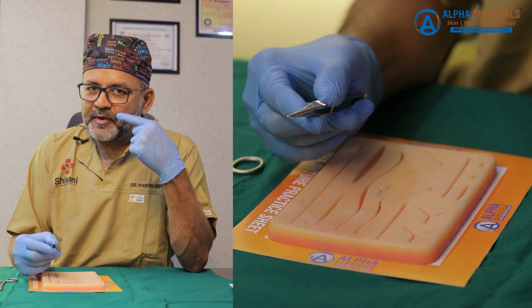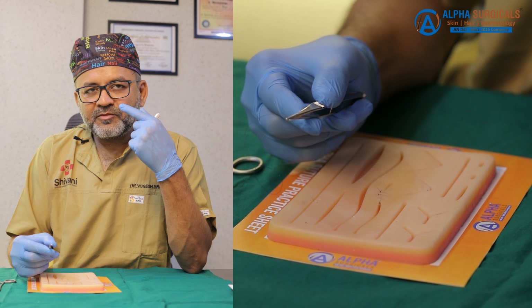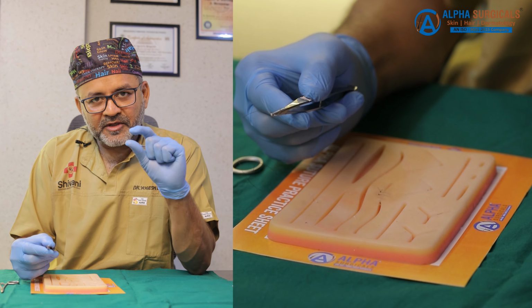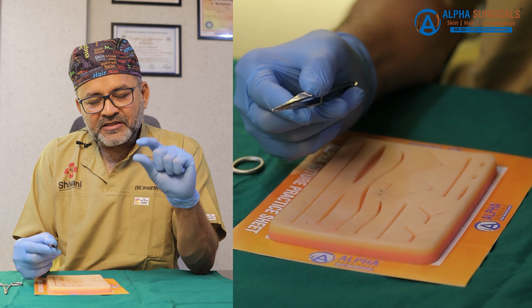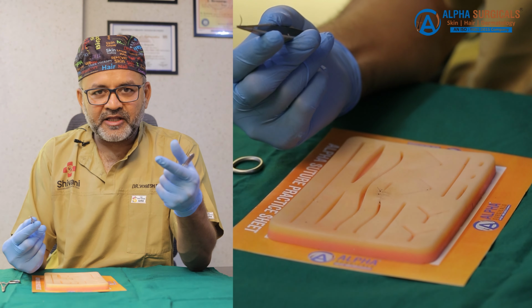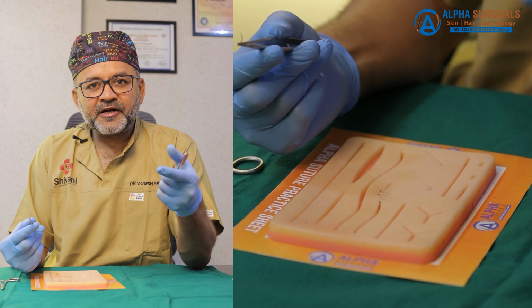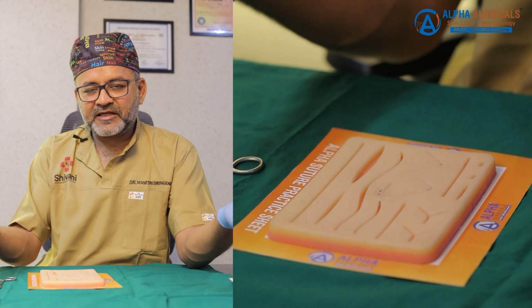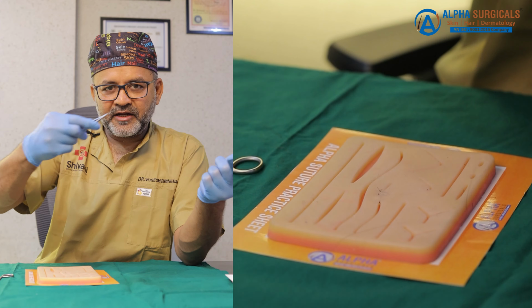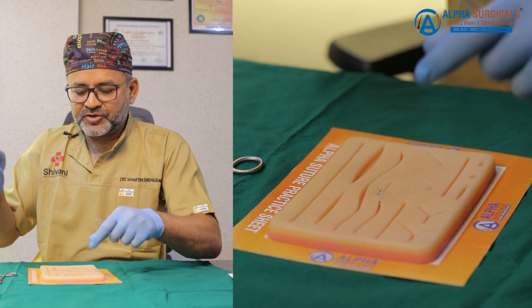Suppose we are working on the periorbital region for blepharoplasty, or for infraorbital fat removal, or maybe for xanthelasma, the thickness of the skin is very thin. In this area there is no tractional pull from the surface, and the depth of the wound is not that much. So in this type of case we will be taking a running continuous suture. On either side we will be putting the knot, and throughout the length of the wound we are taking a running thread. So here we demonstrate the running continuous suture.